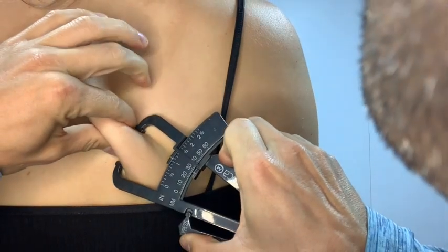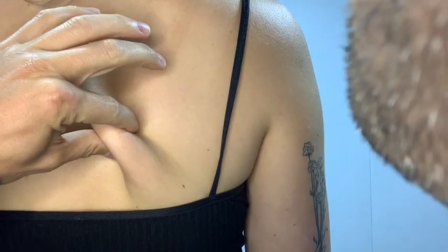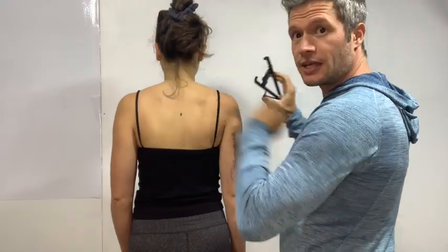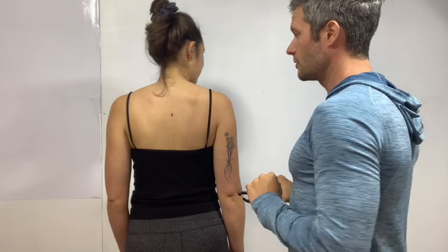From there, I'm going to go in right beside my fingers, little squeeze, just like pull the calipers away, and then my hand, okay? Don't ever leave the calipers on without having your hand there, okay? And yeah, that's essentially how you do that. Again, work through all the sites on one side of the body first, then return to it and go through it a second time for your second measure.